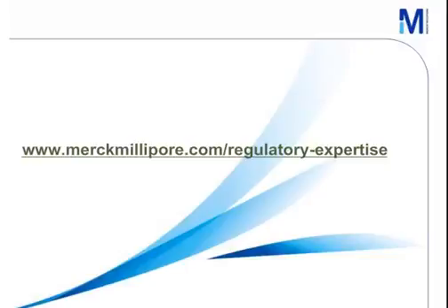Okay. Thank you, Barbara. The next question. Can I validate storing VRBL/VRBG medium if the standard recommends to prepare and use it on the same day? In this case, you have to do the quality control first in parallel, but you can also validate it by your own lab. It is mentioned in the standard that a longer storage than the storage given in the specific standard can be used if it is validated by the lab itself.